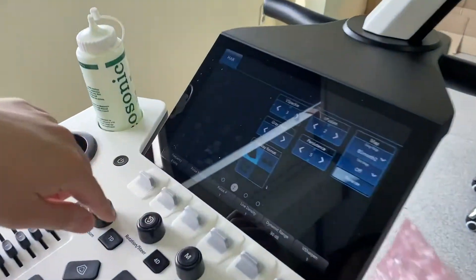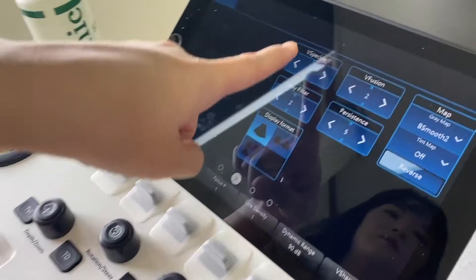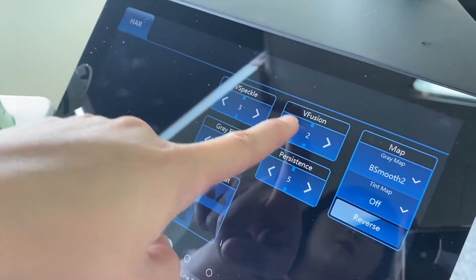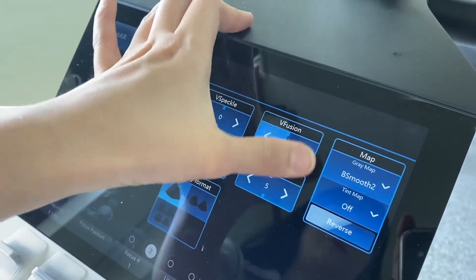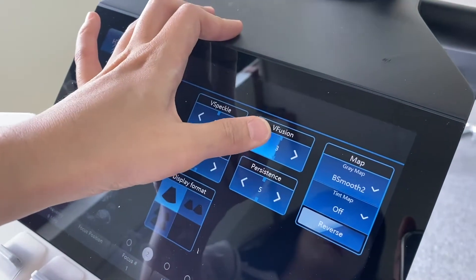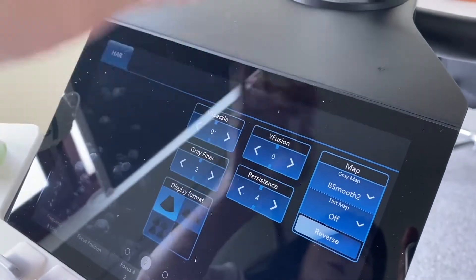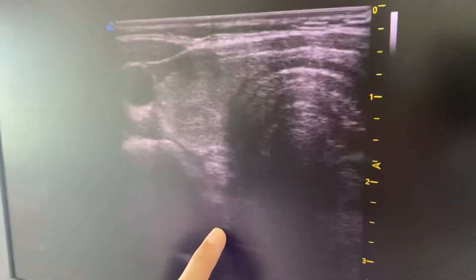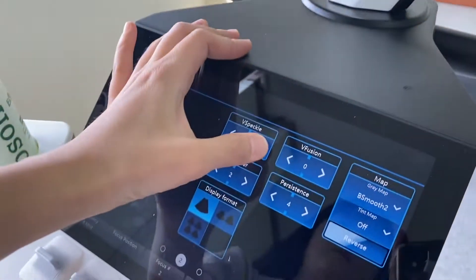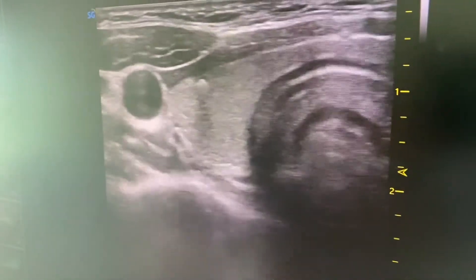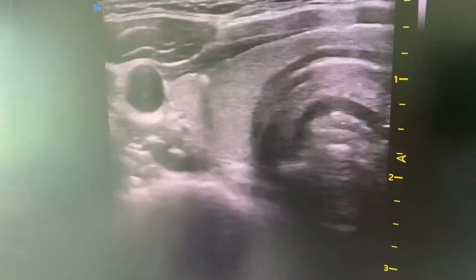In page 2 of the touch panel, there is the V-speckle function. If you turn it to zero, the image quality is very bad — a lot of noise. Go up and the image changes. Very beautiful. The noise has been reduced well.